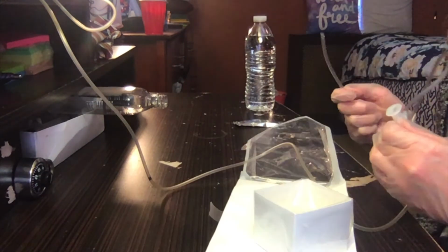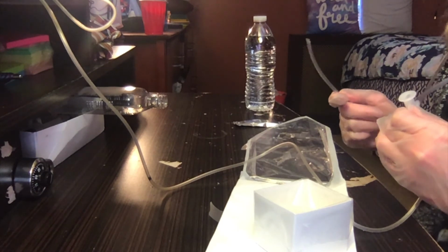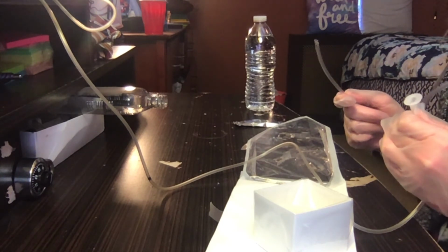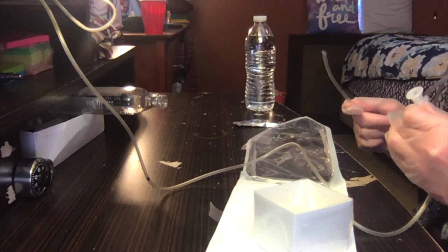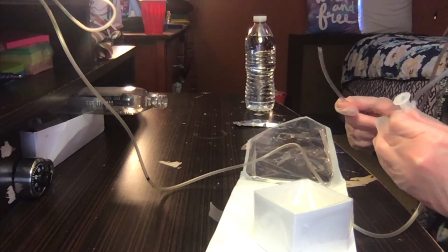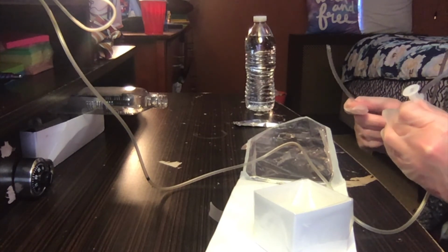Okay, I'm finished. You want to make sure that no more than 3 suction passes should be made per suctioning episode. You want to also make sure that the patient performs oral hygiene. Now I'm going to clean everything up and turn off my suctioning and make sure the patient is in the lowest position in the bed and comfortable.